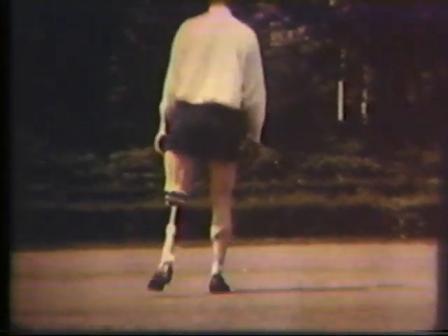Failure to shape the lateral wall properly may also contribute to this defect, as well as building too much abduction into the socket. The abducted gait is unsightly, but even more importantly it alters the patient's normal balance. He is usually insecure and cannot walk rapidly, and this gait also renders ascending and descending stairs very difficult.